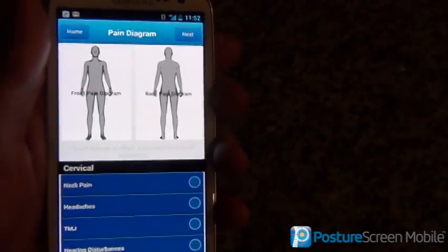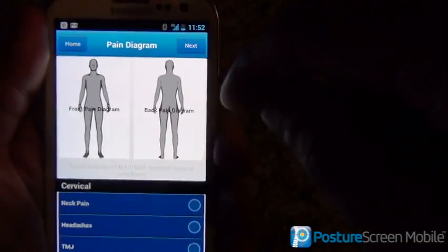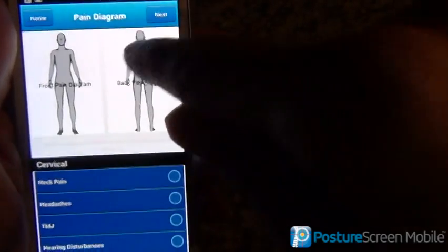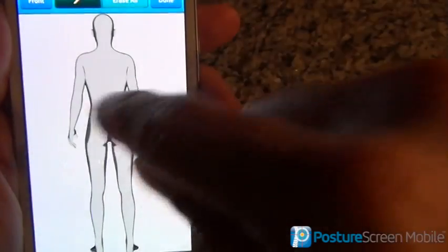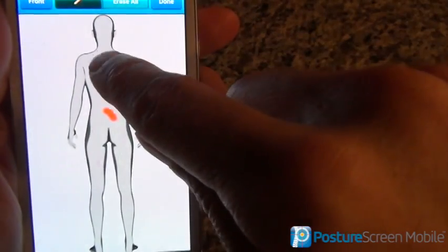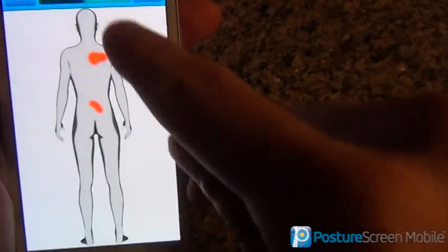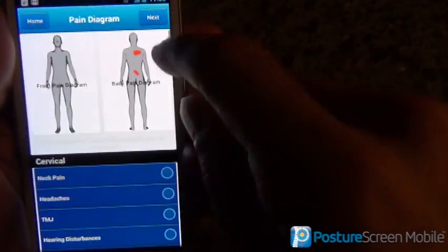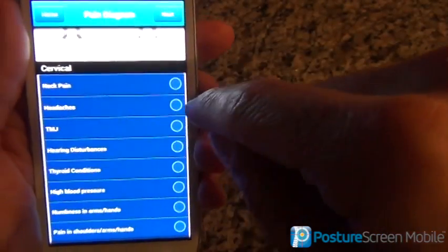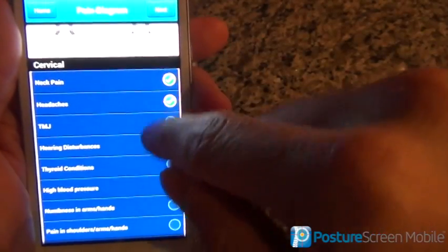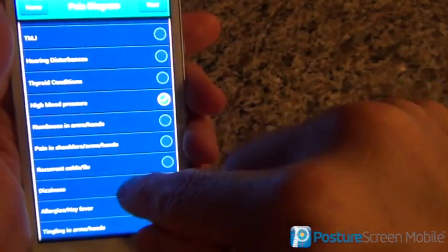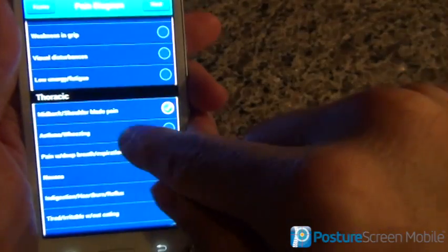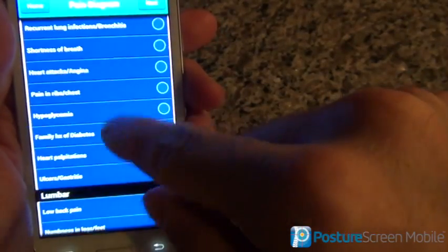Here we have the pain diagram. This is optional and an optional upgrade. We have the front and the back view — I'm going to go ahead and hit the back view. It's a pain diagram, so we mark where the pain is. Then all we do is hit back and hit done. Then we can do the stress survey portion — it's a simple history. We'll say that I have high blood pressure, tingling in their hands, mid-back pain, low back pain — whatever you want to do.